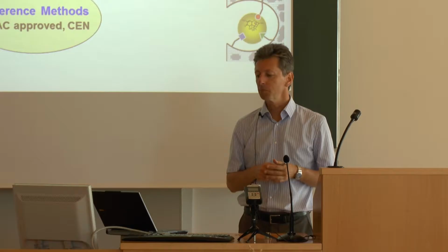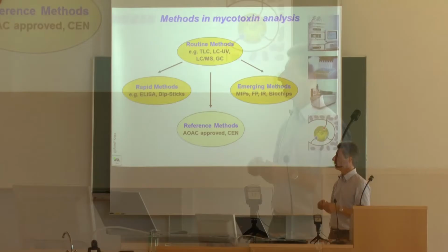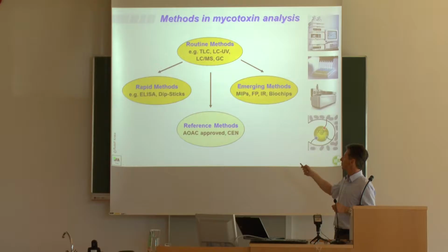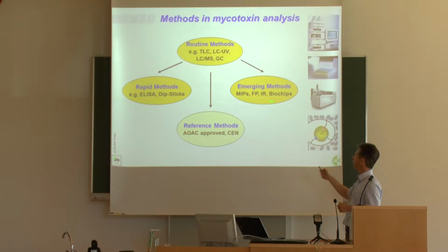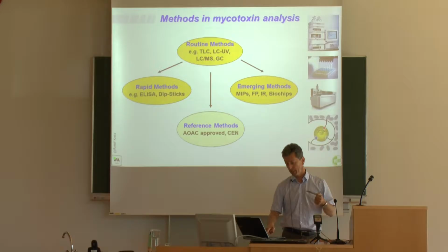We still have to deal with ELISA-based techniques based on antibody-antigen reactions, also integrated in dipstick technology. And talking about Star Trek technologies, there are so-called emerging methods using, for instance, molecularly imprinted polymers, so-called MIPs, as innovative separation and cleanup techniques, fluorescence polarization, infrared, also biochip technology. So there's actually a great variety of techniques which have been developed, and many of those are still under development.